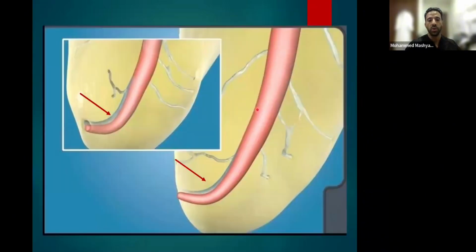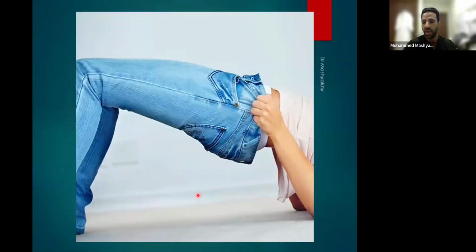If you clean and shape the root canal system, then you fit the cone. Sometimes the cone has its fit from more coronal, from the middle and from the coronal part, because it has a big taper. But actually what we need is to have a fit in the last 3 millimeters, I mean at the apex. That's where we need the fit. And this happens exactly when you buy jeans and you know your size is 30, for example, but after the summer you've been eating a lot, then the jeans is stuck here.